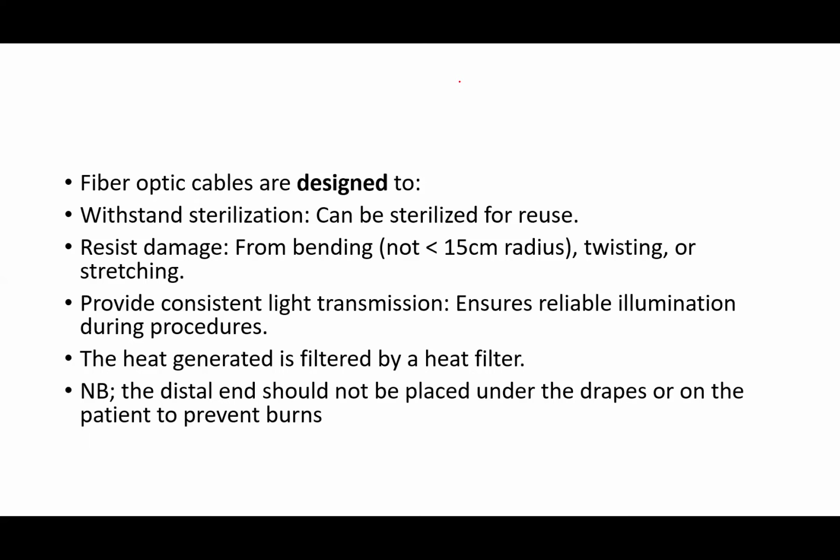It resists damage from bending. So you shouldn't excessively bend or fold it to less than a 15 centimeter radius. During the procedure, it can twist without any issue. It can minimally stretch without any issue.